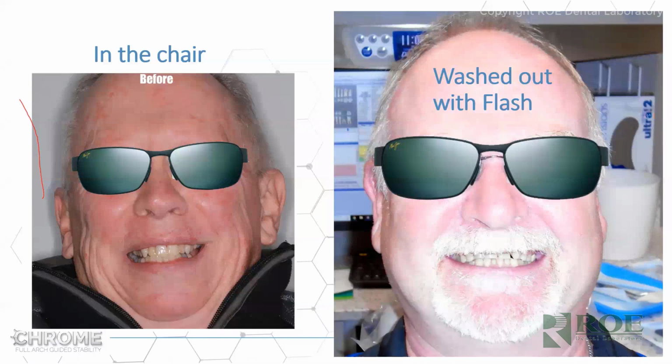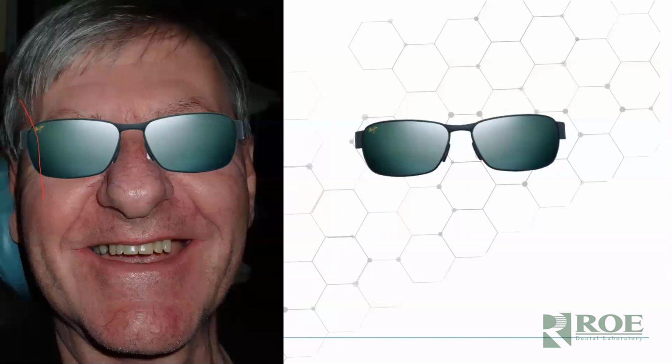The patient on the left, I'd have him stand up. He's kind of leaning back in the chair. Actually, I think he's leaning back in a chair against a wall. Patient on the right, a little too much flash, a little too much washout. One of our goals is to really wow the patient with this record, with this smile.